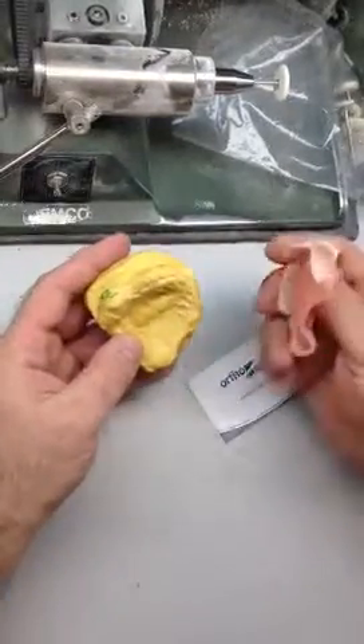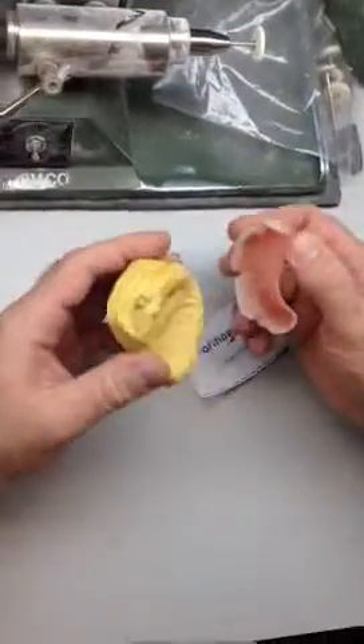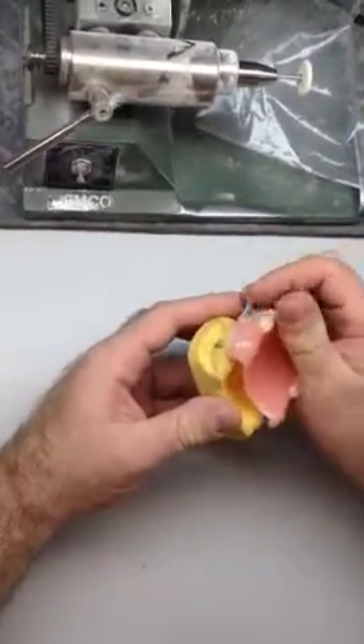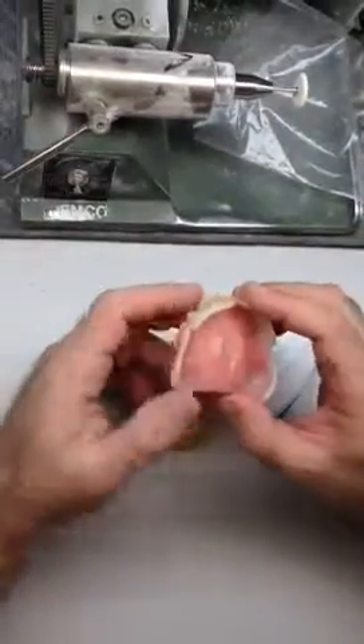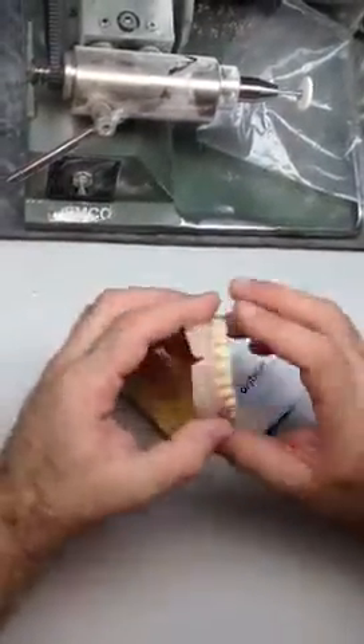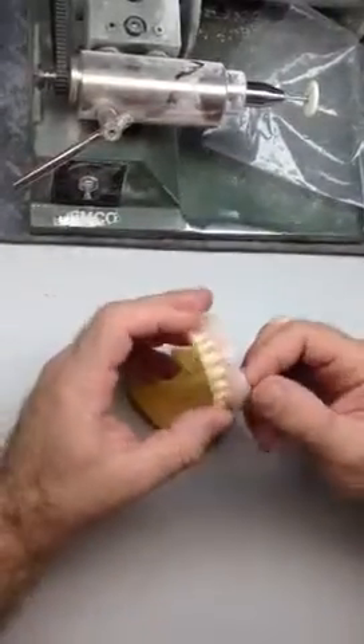The denture still needs to be retained. Because traditionally, what we'd do is reduce the acrylic to make a clear path for the denture to go in. So what we have done — we used silicone. For now it is white silicone, as I didn't have any coloring with me this evening.